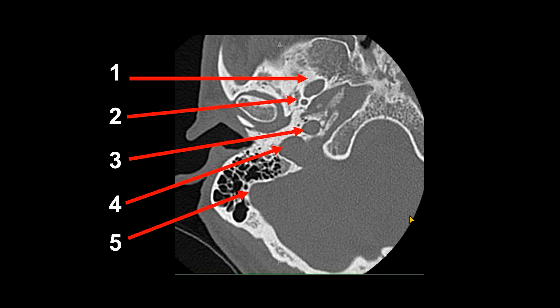We're flipping to look at the right side of the temporal bone and skull base. These structures are numbered for you — you can quiz yourself by pausing the recording and writing down your answers. Number one represents the foramen ovale, the egress of the third division of the fifth cranial nerve — the trigeminal nerve — specifically the mandibular nerve. Number two is the foramen spinosum, just posterolateral to the foramen ovale, which transmits the middle meningeal artery as well as some nondescript nerves.